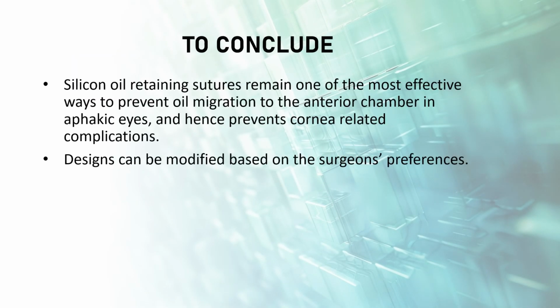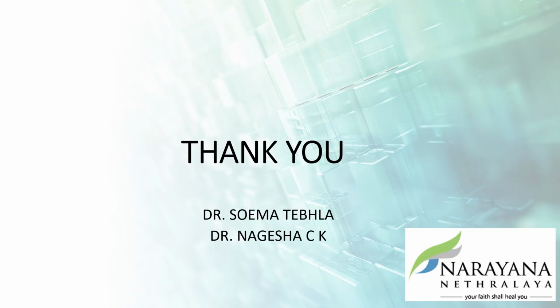To conclude, silicone oil retaining sutures remain one of the most effective ways to prevent oil migration to the anterior chamber in aphakic eyes, and hence prevents cornea-related complications. Designs can be modified based on the surgeon's preferences.